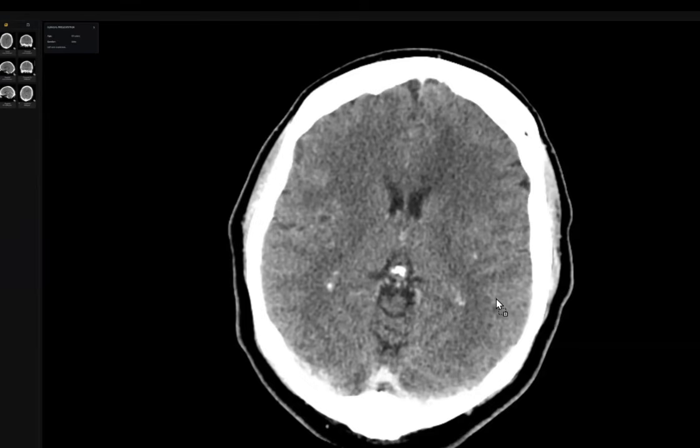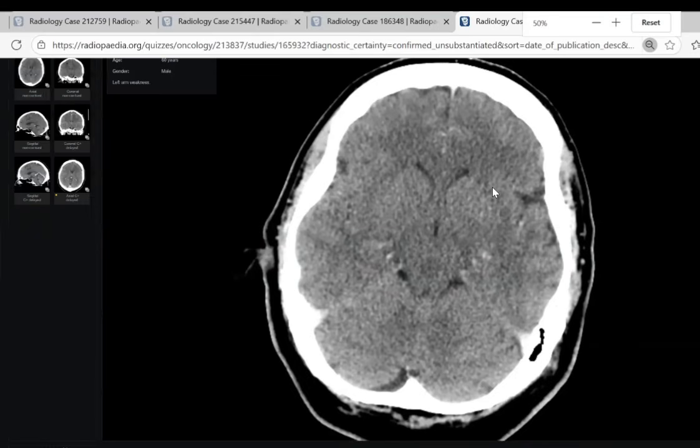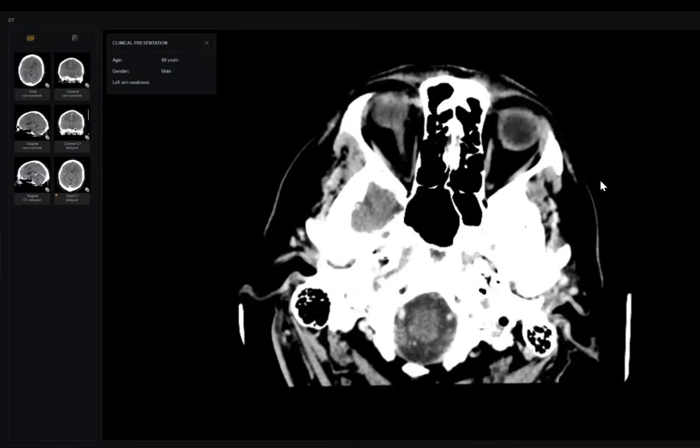So I am unable to. Oh, yes. The examiner will ask you many times to try. See, use the sidebar. No, leave. 1 second. Yes. Use the arrow. Is it scrollable? Okay, I will help you. No, sir. Go on.